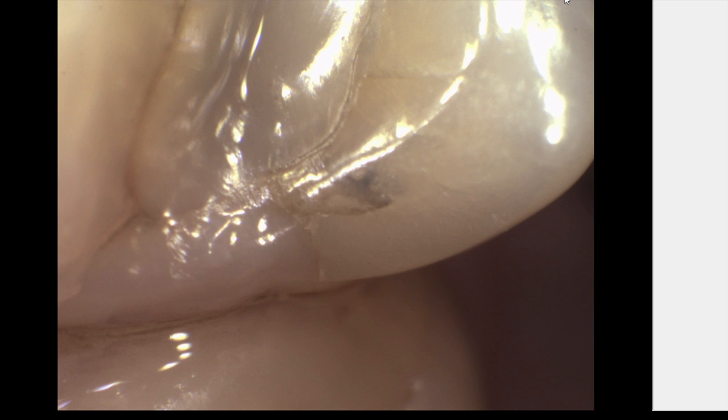Here's another tooth that has a strange black spot in it. Doctors I've spoken to about this have said that they would probably try to use a probe on this, and failing that they would certainly take an x-ray. But an x-ray would show them one view of this spot.